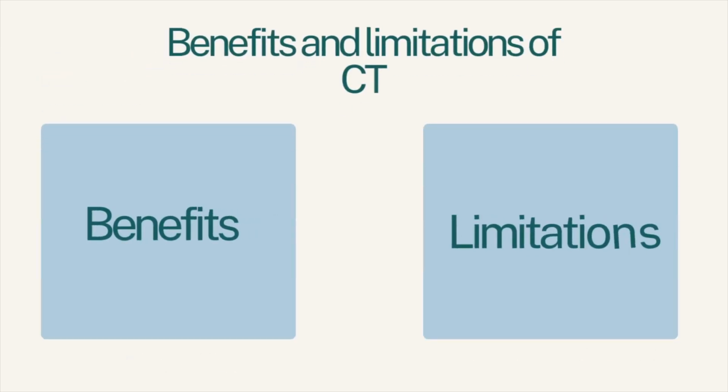So with anything, there are benefits and limitations. The benefit of CT is it's really clear imaging. You can really see the cancer or the tumor of any dangerous diseases. And the limitation is it can take long. There's a lot of long-term preparation sometimes, and it takes 15 minutes for a complete scan.